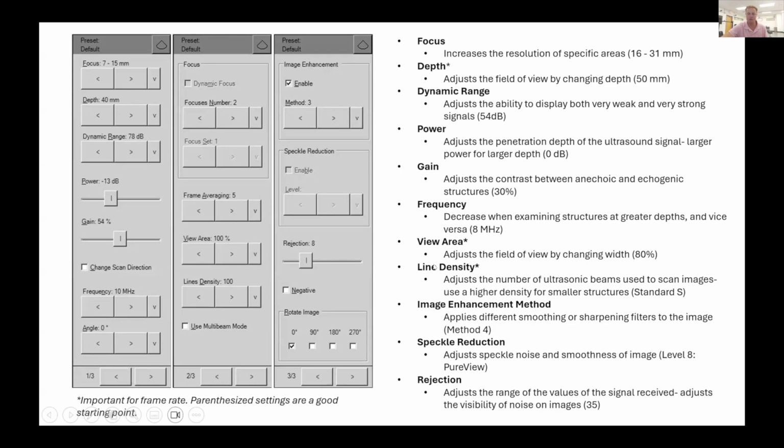It's really just showing you the range of settings that I personally think are worth experimenting with to try to optimize your ultrasound image. The optimal settings can vary from patient to patient, from muscle to muscle, depending on the patient's body composition, and the muscle's size or depth in the image.